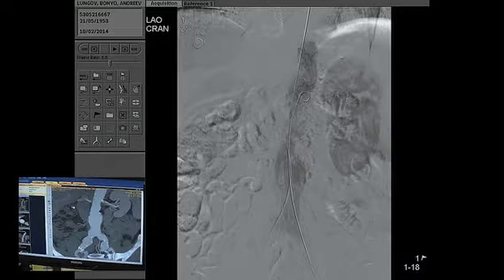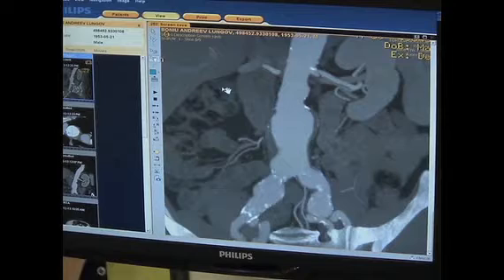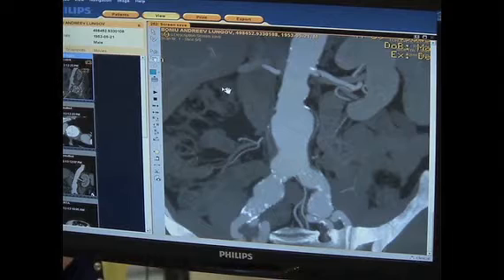We have discussed a little, especially on the left side, if it will be possible to seal the aneurysm without covering the left hypogastric, and we decided that it will be possible. In fact, we didn't open yet the left side flared leg. So in case you advise us, we can even cover the hypogastric. I think that it will be possible not to cover.